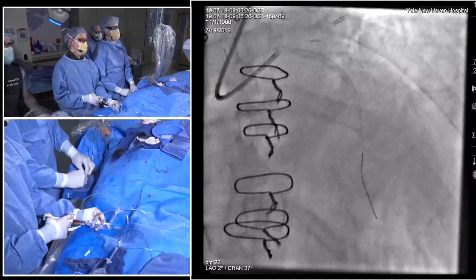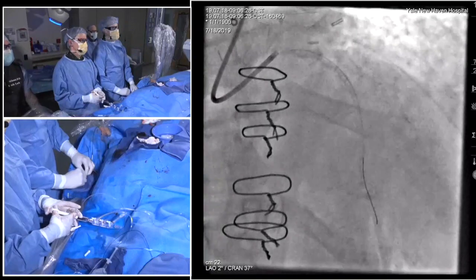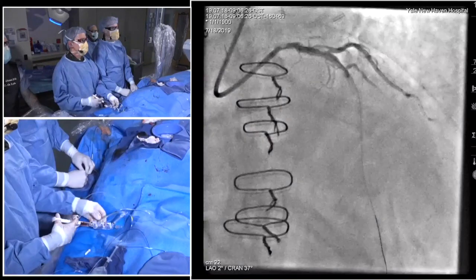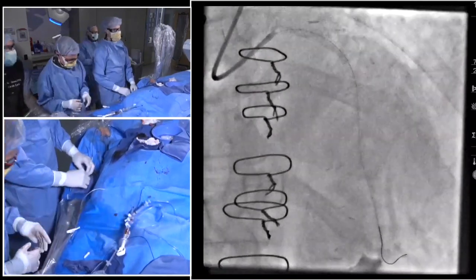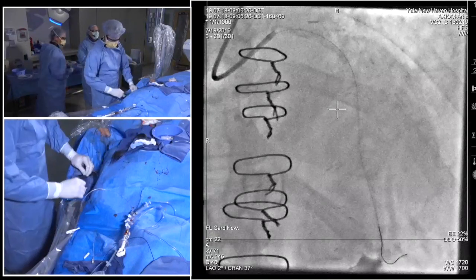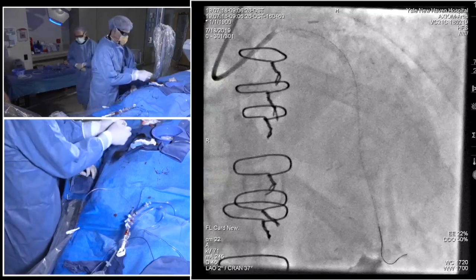The other thing is FineCross catheters often get ripped up by rotablator burrs. It's probably better to use a braided microcatheter. They tolerate it better. Colleague Kevin Kroos has done a number of cases with CSI next to a FineCross, and that actually works fairly well.